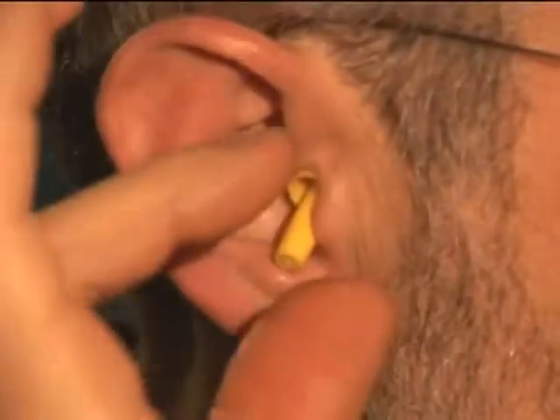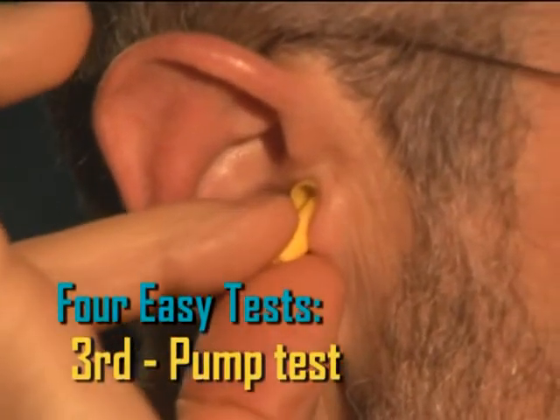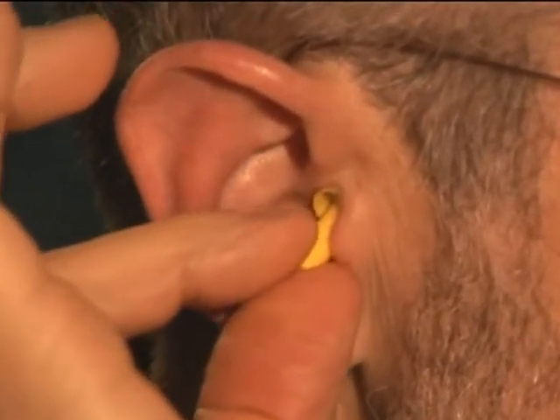On the in stroke, you are compressing the trapped air, and on the out stroke, you are releasing the pressure. This compression and release will push and pull on the eardrum, moving it back and forth. You will feel this as though you were going up and down in an elevator or ascending and descending in an airplane. If all you feel during the pumping is a sense of touch in your ear canal and you don't feel any of this pressure change, then the plug is not properly sealed.